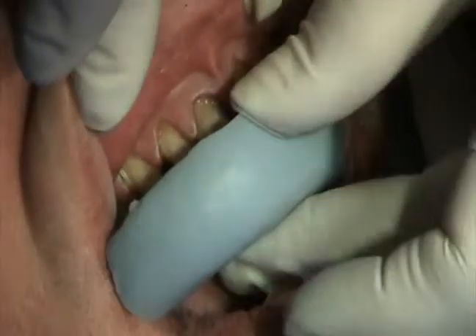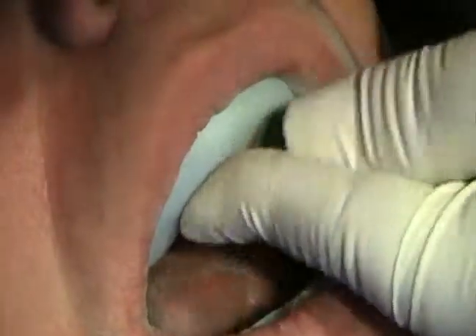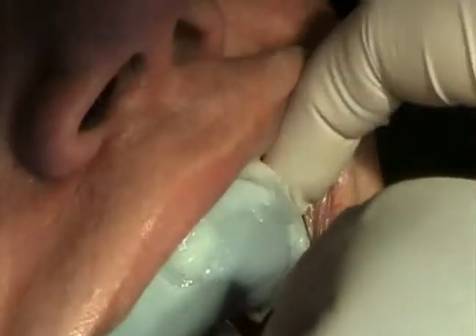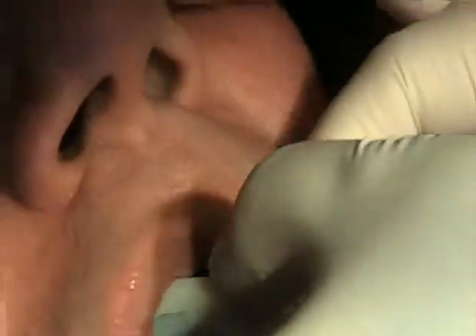Now in the interim, the patient's going to wear a temporary. Notice we've got a liquid plastic that we place in the mouth and that will set for a little bit. We'll take that out and show you what that looks like on the inside. There we go.